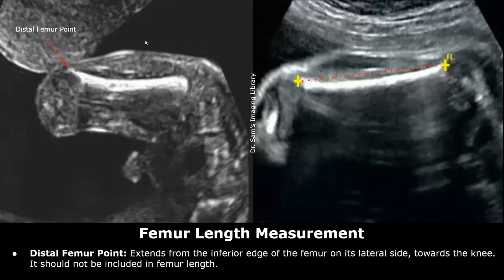The distal femur point is a short extension seen from the inferior edge of the femur on its lateral side towards the knee. The knee is in this direction. This point should not be included in the femur length measurement.